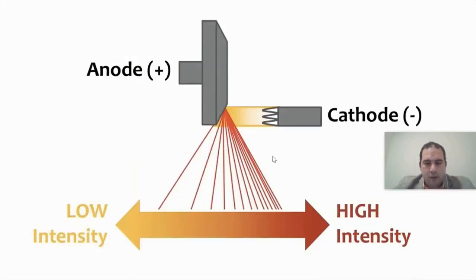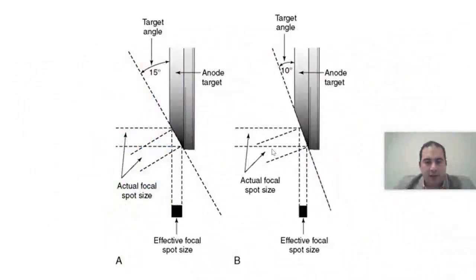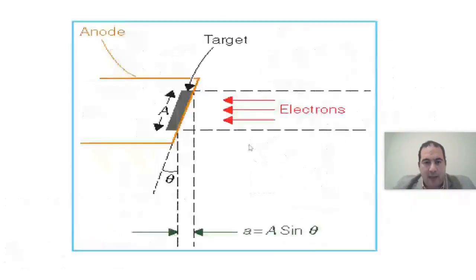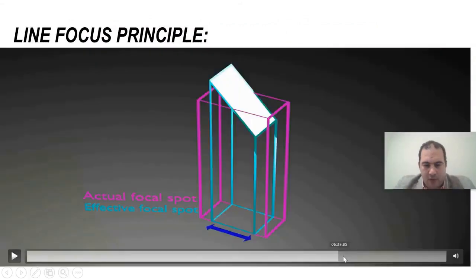Furthermore, I want to say that before we get into this particular area of discussion, specifically related to focal spot size and its dimensions, when we were talking about this video earlier on, did you find anything here? What exactly is getting smaller?